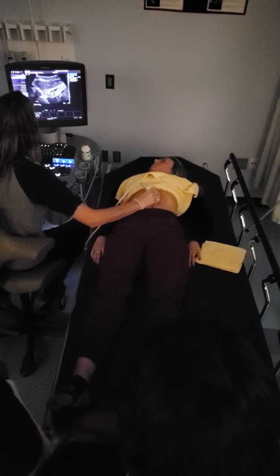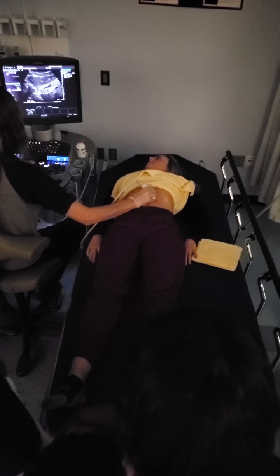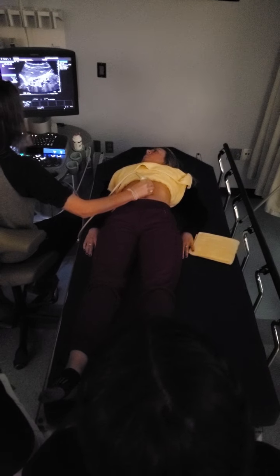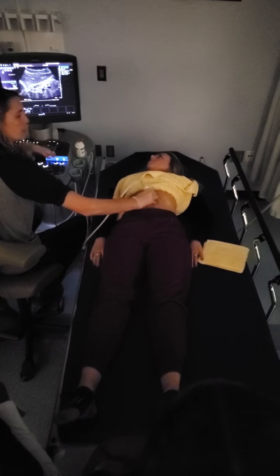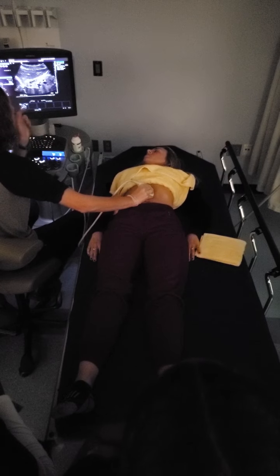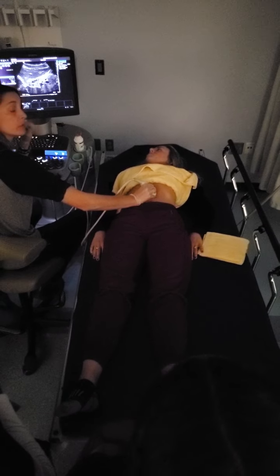And in this case, do I need 2 images? Yes, I do. All the images. And then we're just going to slide immediately down and collect that inferior. How are we feeling so far? So, pushing and scooping to that mid, moving under that costal margin to getting that most lateral. We had to take 2 images for the medial and 2 images for the lateral, but we didn't have to do it for the mid.